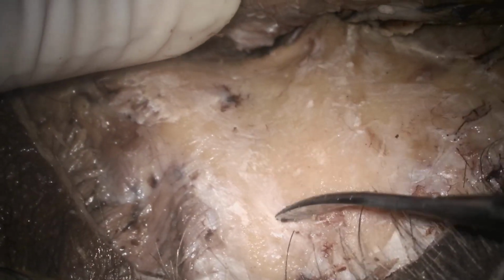Elevate all the soft tissue off the bone. Okay, and look, here is a venous channel. This is an emissary vein. Okay, can you see it? This is the emissary vein. No, it's out of the field, out of focus. Okay, out of the area. Now, yes, visible.